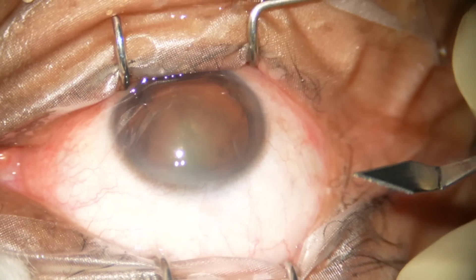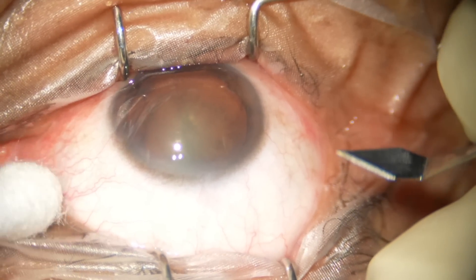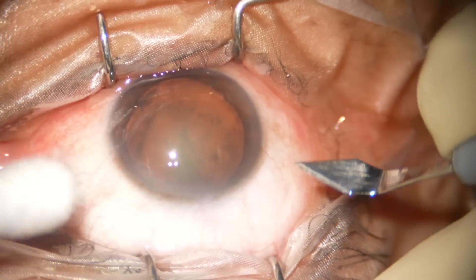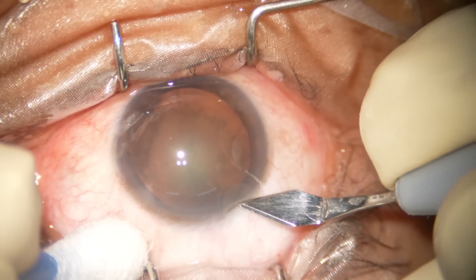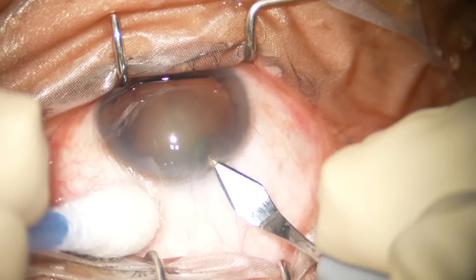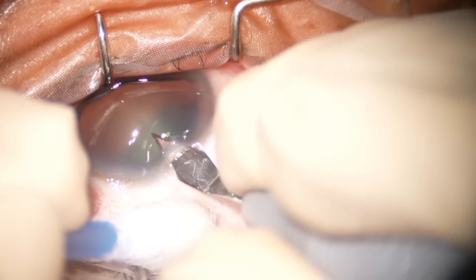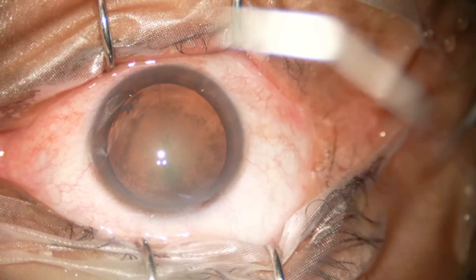My routine is I place the main incision first — you can place the side port first. This is the side of the main incision: go forward for a distance and then go downward. And that's the main incision made.